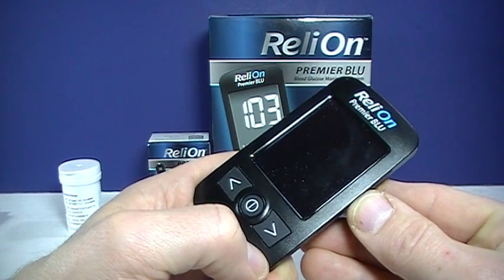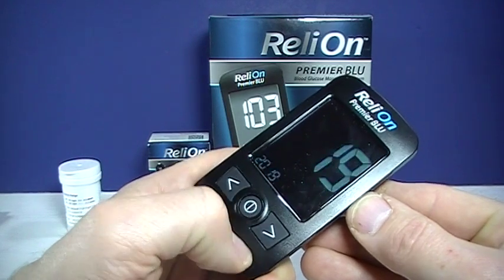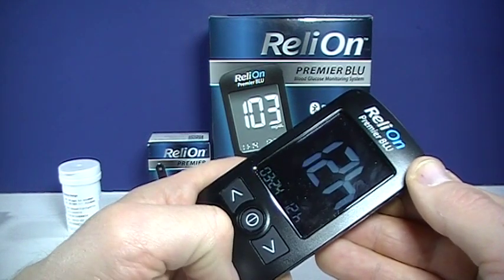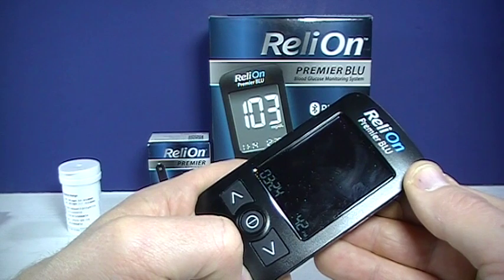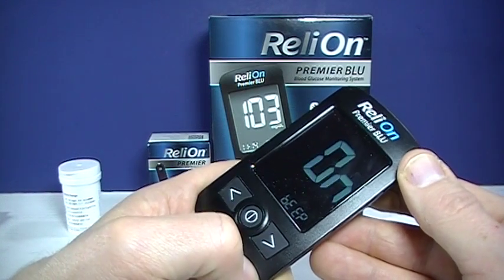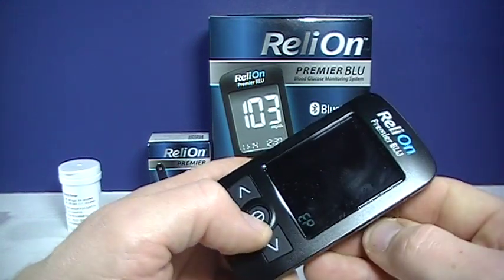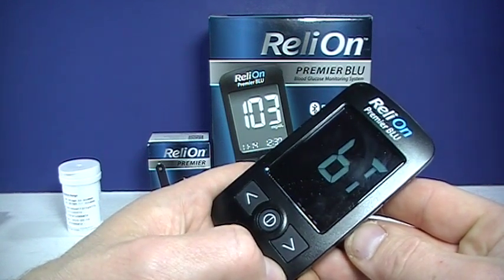Right there is your year — you can choose the year. Next is the date. Press the center button to set that, then go on to the month. You can use the arrows to adjust or the center button. Then we go to the date, then the hour — if you prefer the 12-hour format or 24-hour format, this is your point where you can choose that. Then you go on to the time, select the minute. And beep — if you like it making the beeping noise, you can select that. This function is if you want it to prompt you when the test strips you're using are expired. This is a hypoglycemia alarm that you can set. And then we're back to the Bluetooth.